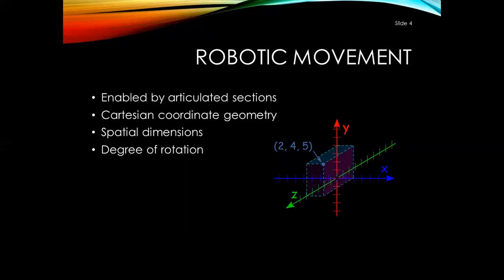Right, so let's talk about robotic movement quickly, since it's kind of boring. Surgical robot system movements closely resemble the actions of the human body, allowing the arm to move up, down, side to side, and back and forth. That's the difference between using a robot and just doing minimally invasive. Minimally invasive, you're really reduced at how much movement you can have, whereas with robot, it's just like a wrist. So the robotic arms are just like a wrist, if you'll remember that, okay?